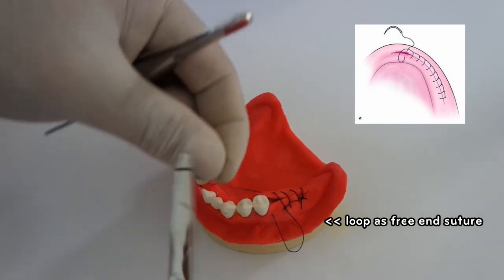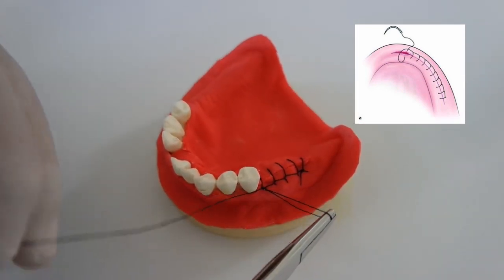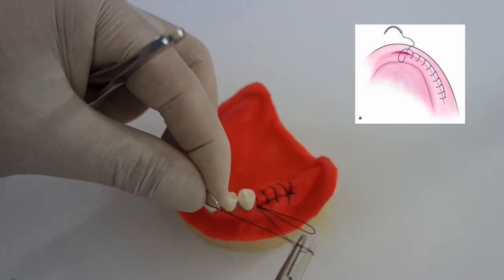For the last suture, the loop created serves as the free end of the suture. Tighten the two ends, create the surgeon's knot.